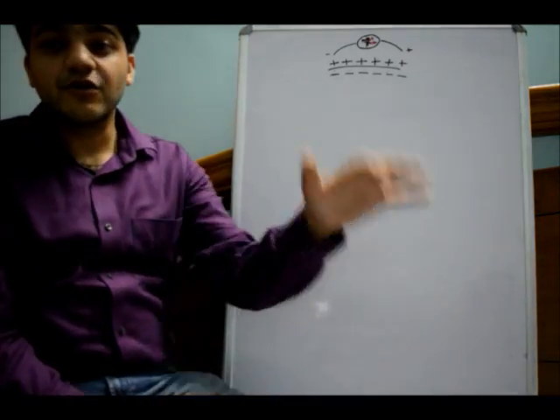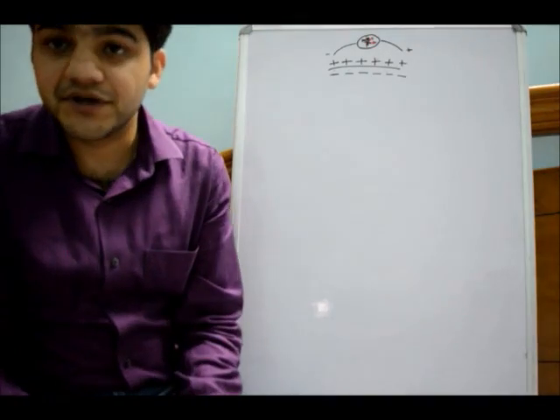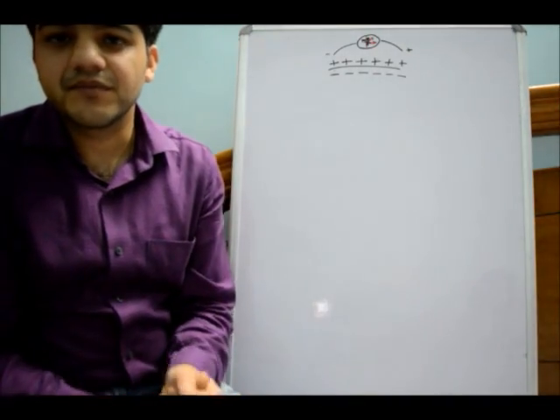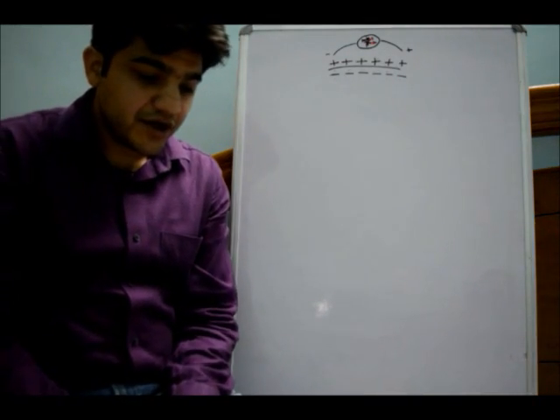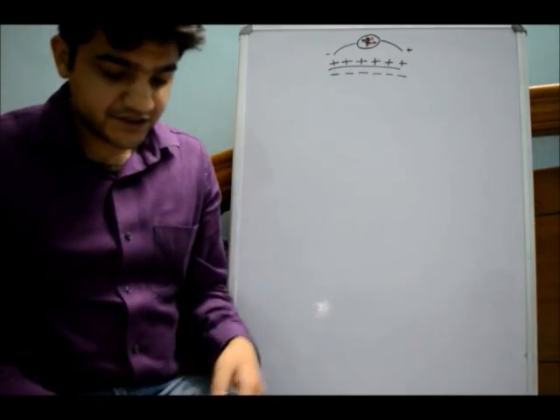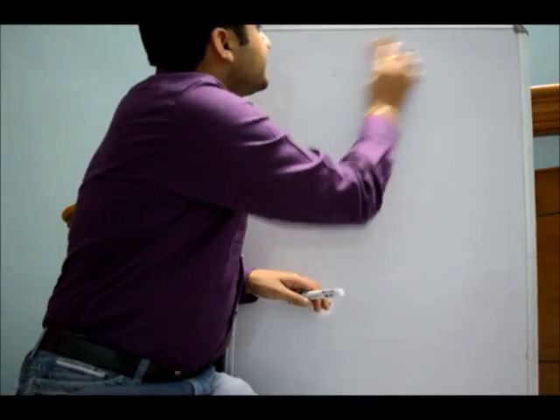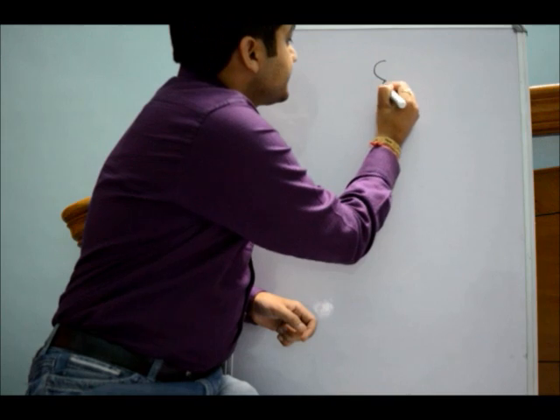Okay, this is how depolarization and repolarization occur and how they are recorded by means of a voltmeter or ECG leads. Now the heart lies in an oblique direction in the chest, in the body. So the heart lies somewhat like this.